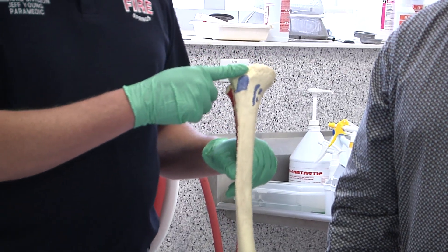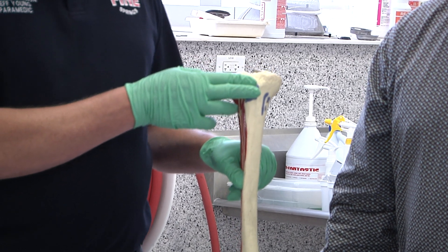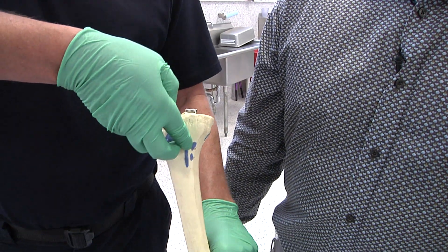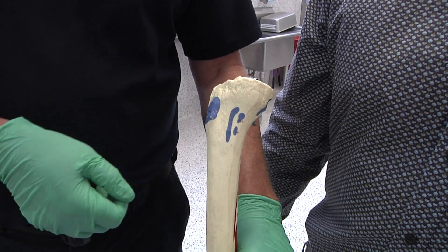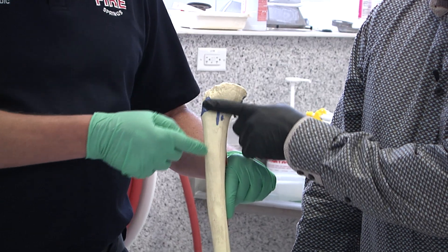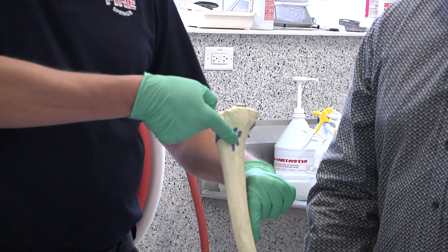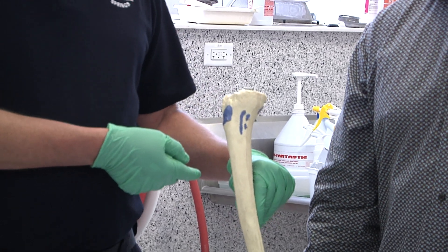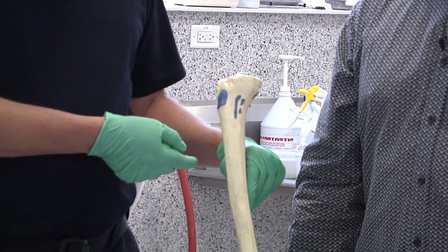How do I identify the proper landmark for a proximal tibia? We go two fingers below, distal to the tibial tuberosity, and one finger medial — that would be our point of insertion. Remember, this leg is a little laterally rotated, so this is going to be pointing straight up and we'd be able to insert here. It's a nice flat area and typically has very little soft tissue over it in most circumstances, which is why this is our primary site for IO insertion if there's no contraindication — and it's typically very successful.